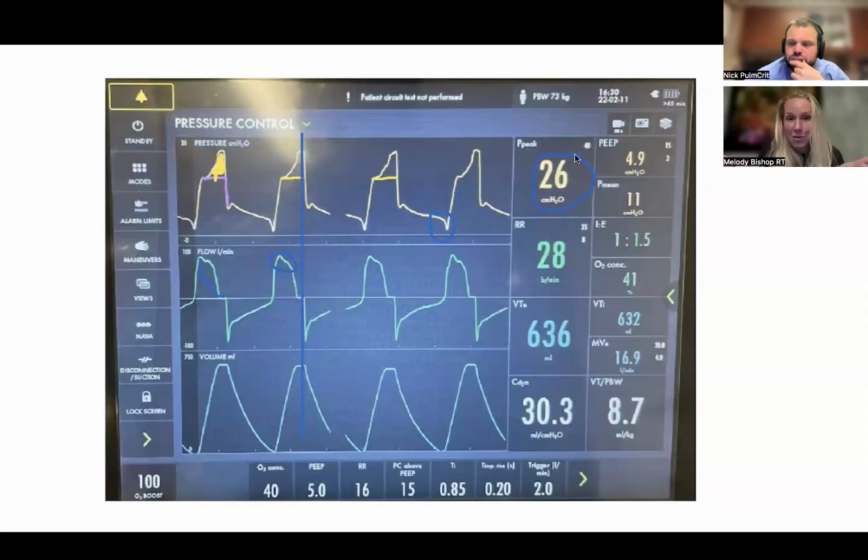And I think all I'm doing there is eliminating one more variable that the vent is putting on the patient that might be confusing the waveforms. It's not so much that I want to see what the patient's doing so much as I'm trying to eliminate the dumb ventilator that's screwing up something. If I can eliminate that and then see the patient working underneath, then me as a clinician can say, okay, ventilator, I'm going to fix this now. Now that we know what the patient wants and I'm seeing their own cycling, I'm going to go back to a control mode and match that.